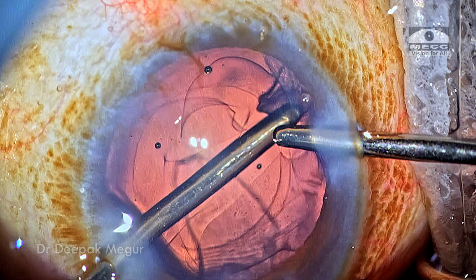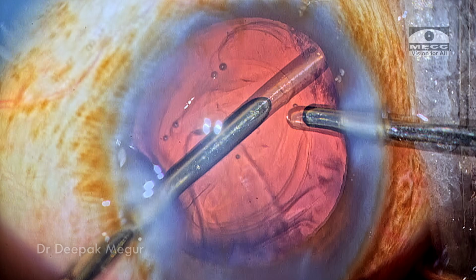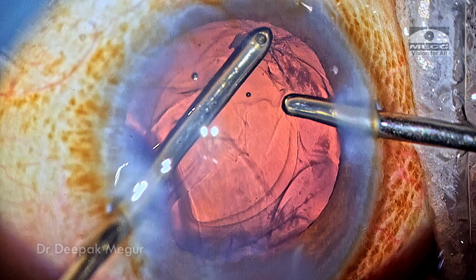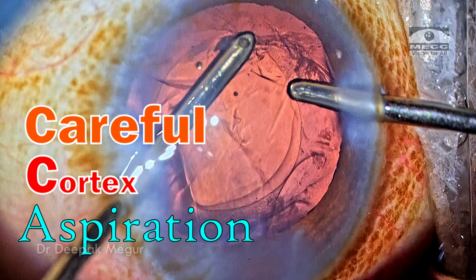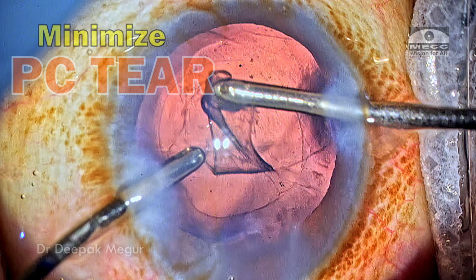So it's critical to identify these subtle changes, and if required, putting in a CTR would definitely aid the procedure, but being very gentle in cortex aspiration is very helpful to minimize the occurrence of posterior capsule tear in such eyes.